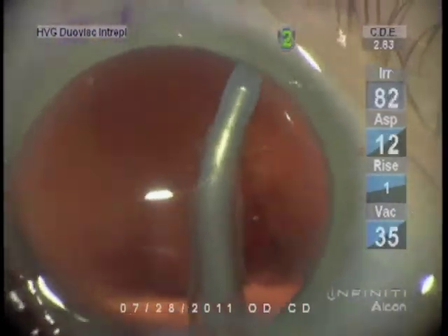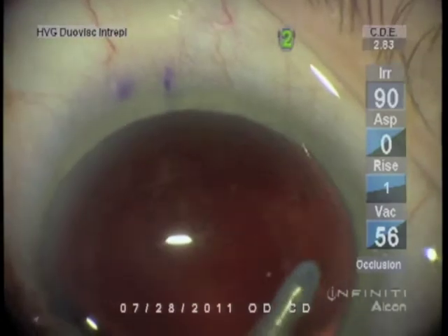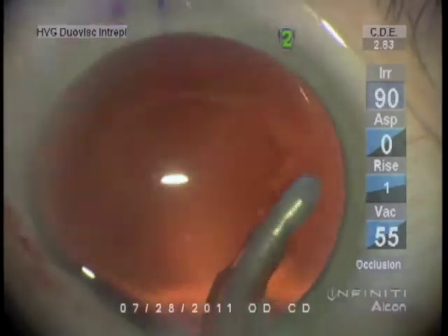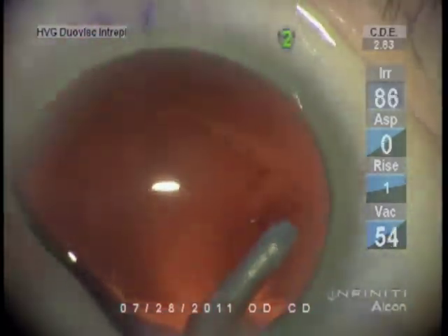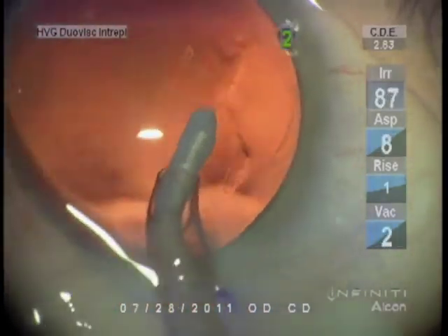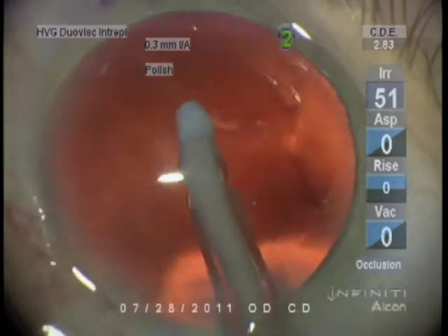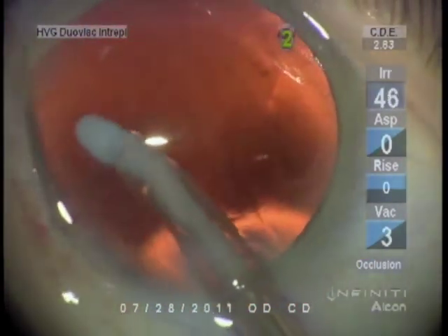I'm careful not to go too close to the equator because the capsule is loosely attached at the equator. The zonules are attached a distance away from the equator, so one has to be careful in the equatorial area not to put vacuum to the capsule.